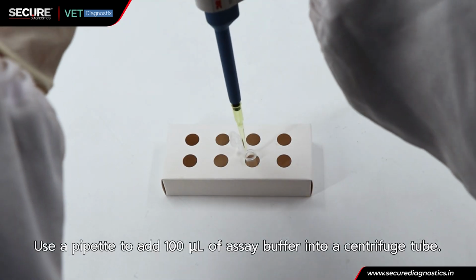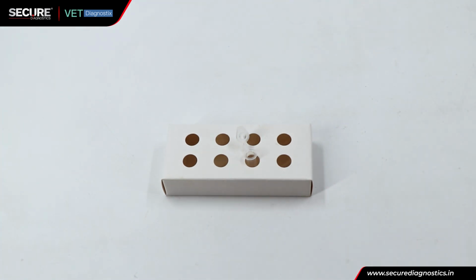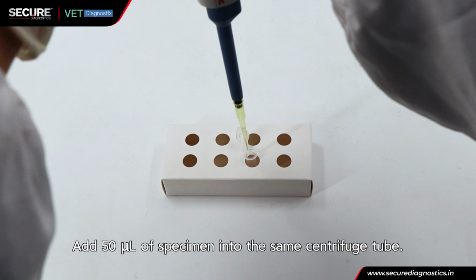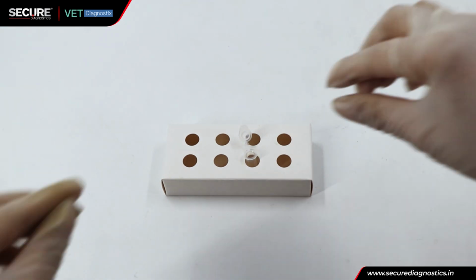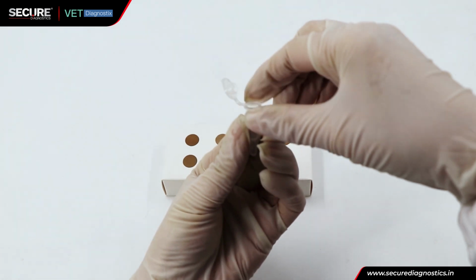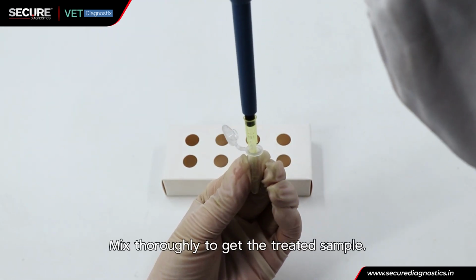Use a pipette to add 100 microliter of assay buffer into a centrifuge tube. Add 50 microliter of specimen into the same centrifuge tube. Mix thoroughly to get the treated sample.